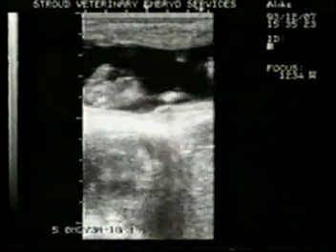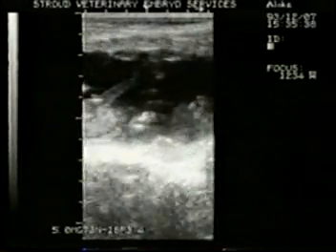Although the presence of a male genital tubercle is diagnostic of a male, the absence of a male tubercle does not in itself guarantee a female. The ultrasonographer must visualize either a male or a female genital tubercle to accurately diagnose sex. The other two most beneficial orientation aids are the head and the beating heart of the fetus found in the thorax.